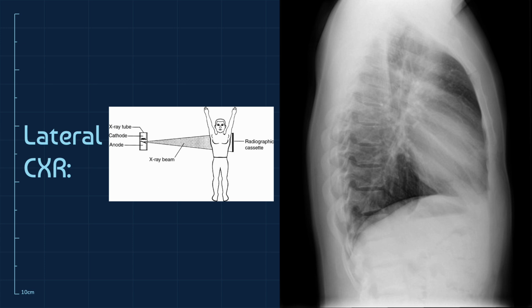So it's always important in radiology. One of the gold standard rules is to always compare your radiographs to previous radiographs if they are available, and always obtain a second angle. These are like golden rules of radiology. Always keep in mind, if you're not sure where something is or you want to be absolutely sure, then order a lateral chest x-ray.